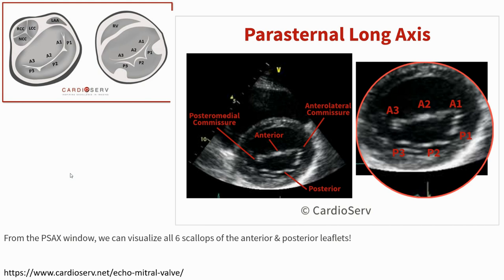Parasternal long axis again — no, it is a mistake. So here is what we call the parasternal short axis. In this view we can visualize all six scallops of the anterior and posterior leaflets. On this view we can see all of A1, A2, A3, P1, P2, and P3 using the parasternal short axis.